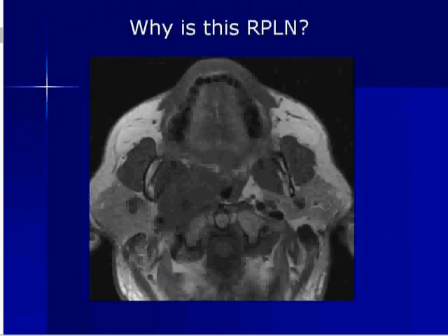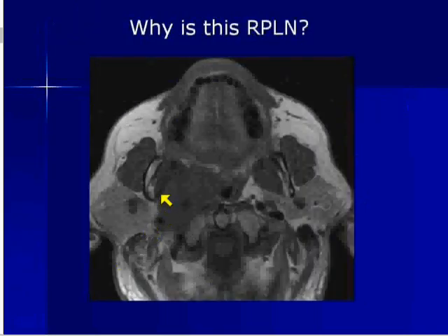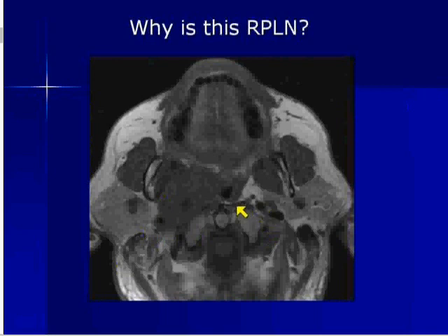So why is this a lateral retropharyngeal lymph node? If you notice, this is not the jugular vein — this is the internal carotid. Here's the normal side. This is the internal carotid. This is the longus coli, longus capitis, depending where you are in the oropharynx or nasopharynx. And in between the internal carotid and the prevertebral muscles is where the lateral retropharyngeal lymph node lives.